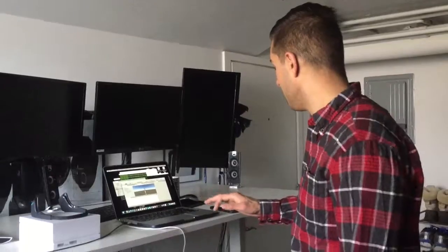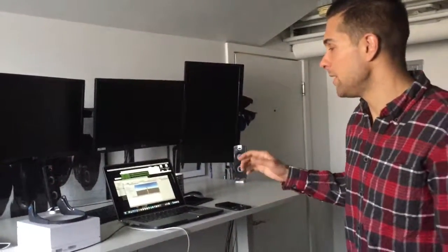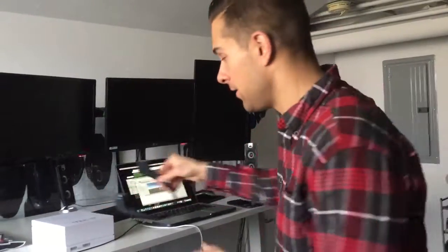This is a pretty sensitive system, so it might not be completely smooth. One major problem to fix going forward would be to smooth it out. When the threshold gets crossed and it sends that message to Unity, it seems to bombard Unity with it, and Unity will eventually animate each time. So it gets really hard to break up the individual gestures. But that would be the next step. This might take a second too, because the sensors have to get aligned.